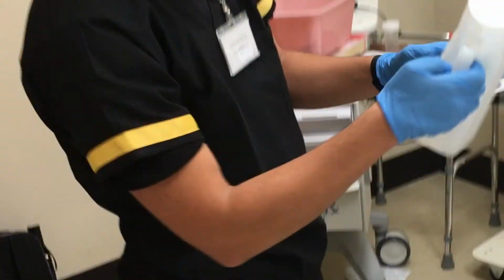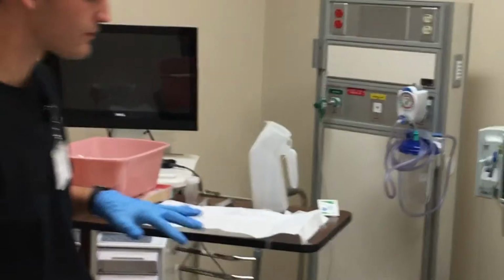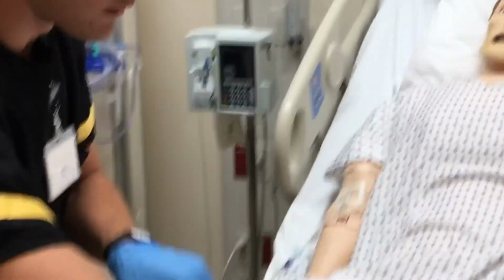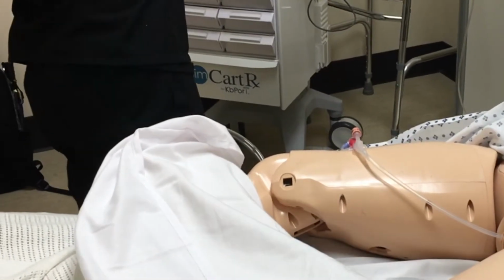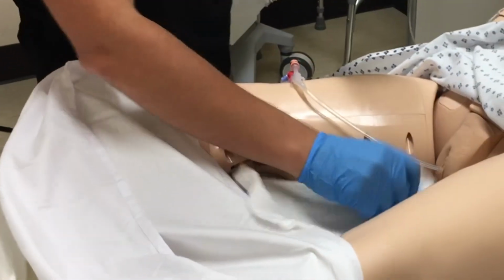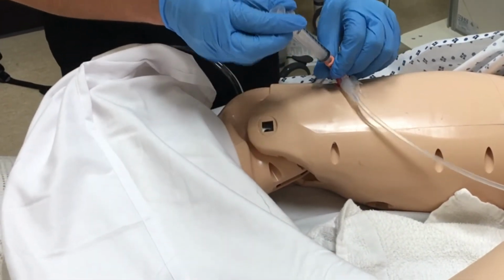Okay, you've got about 600 milliliters of clear urine, light yellow, so that's good. Now, I'm going to come over and remove your catheter. So what I'm going to do first is take a towel and put it down right here. I'm going to deflate your balloon.